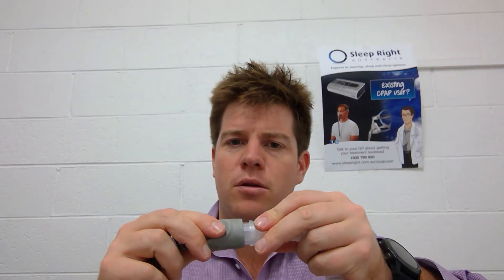So if this is an issue you're finding, simply pull out the old connector and then try again, and you'll find that your mask will connect with the CPAP tubing.